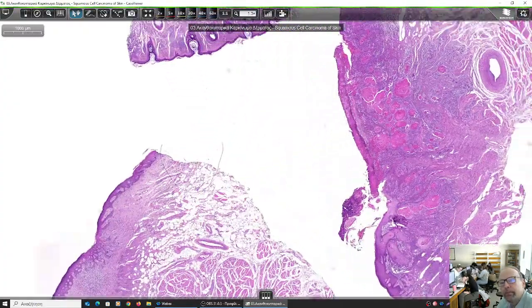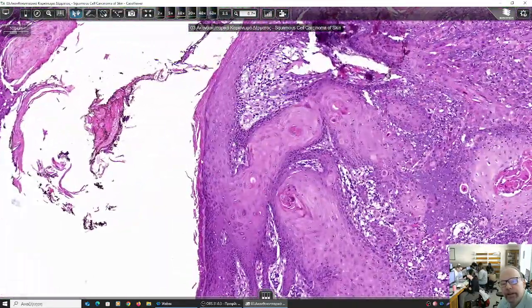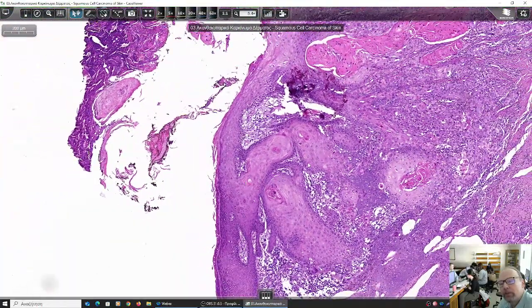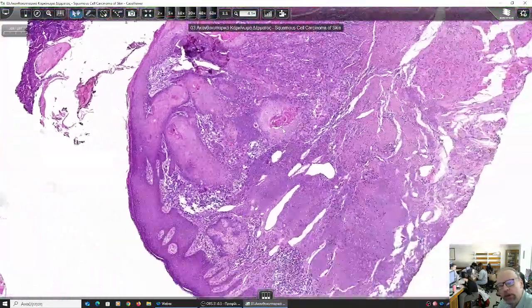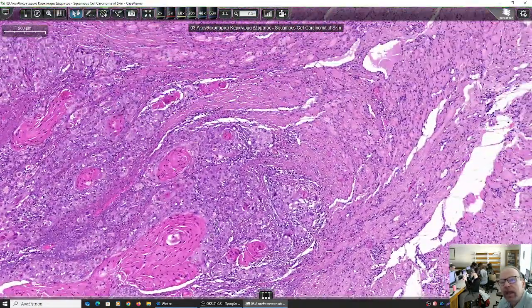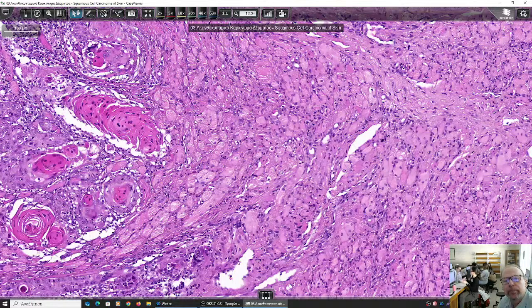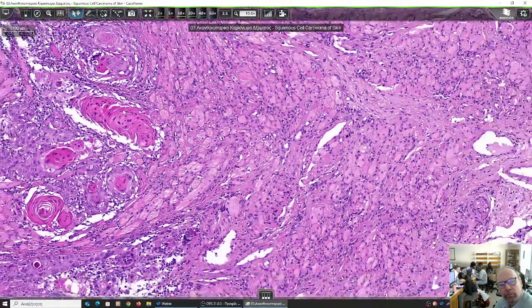Now we have skin, that we have keratinized epithelium. You see the keratin? However, we have some downward proliferation of irregularly shaped cells. And have a look, Fotis, where they enter. What tissue is this? You see that this tissue here is being invaded by these cells. This must be muscle tissue, some sort down the lamina propria of the skin, the dermis, okay? So we have invasion.